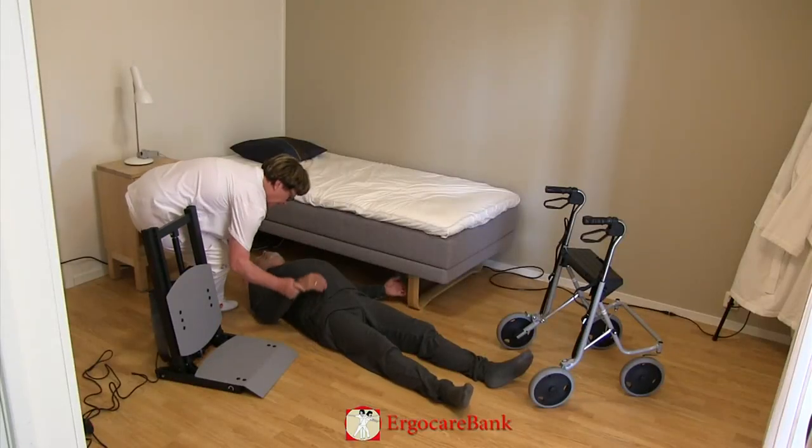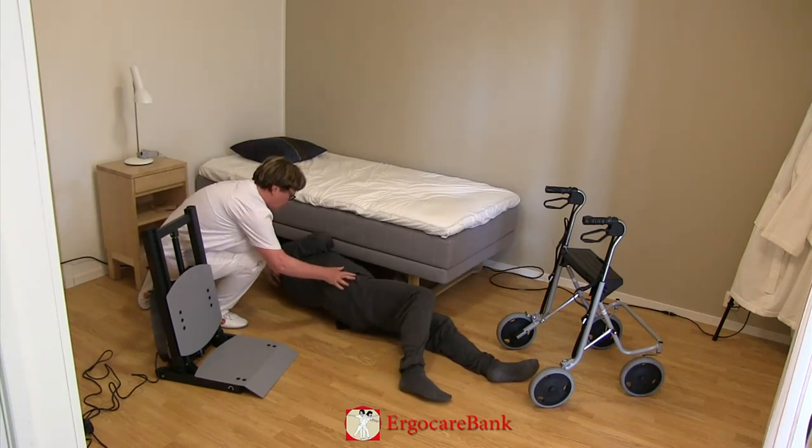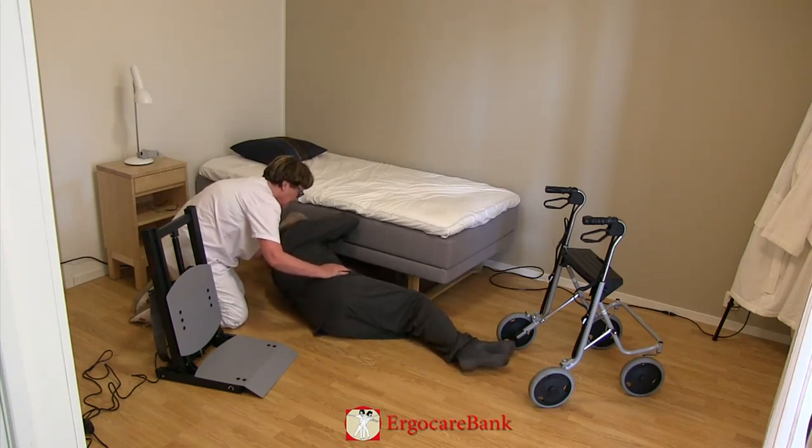Bert is instructed to roll over to the side, pull his knees up, and push himself up to sitting.